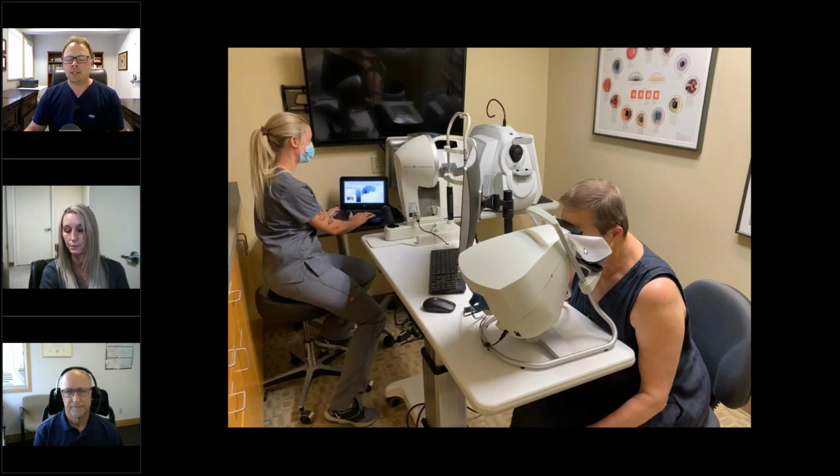So we decided to just continue with our FDT, not utilize this as a screening tool at this time, and keep it in the back in the special testing room, where it's a little closer to the clinical setting, with fewer steps for the patients to walk to do the test on demand. Yeah, you pretty much put it as the focus of on-demand perimetry. That's clear. Yep. Okay.